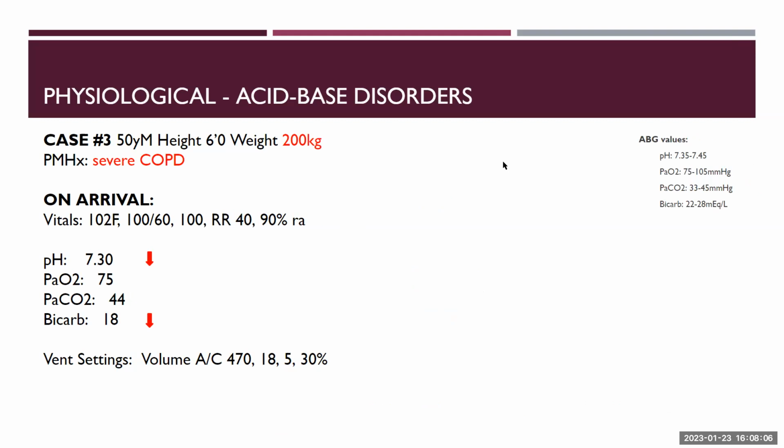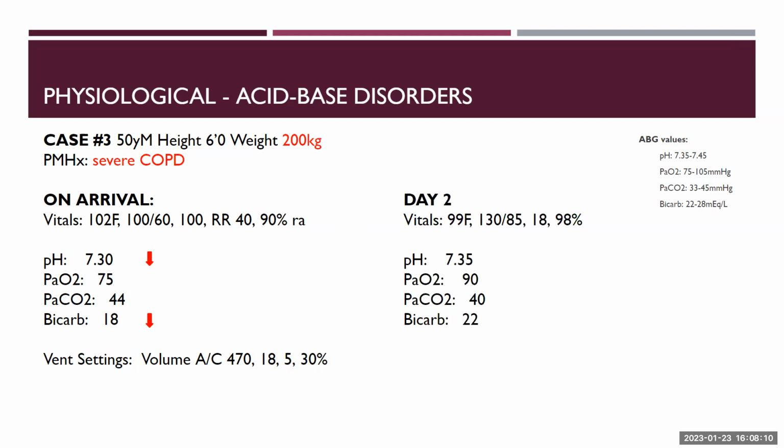Kind of a similar patient, severe COPD, but now they're 200 kilograms. And this is their day 1 next to their day 2. What are your thoughts about what's going on? Any changes you guys have to make or want to make, or are they closer to health?